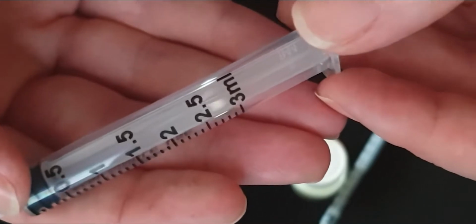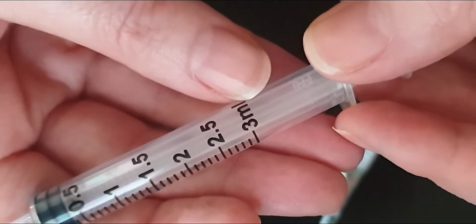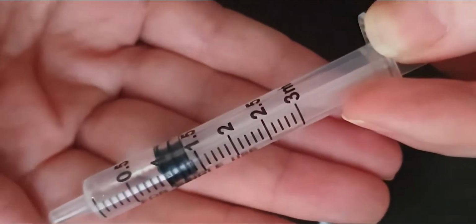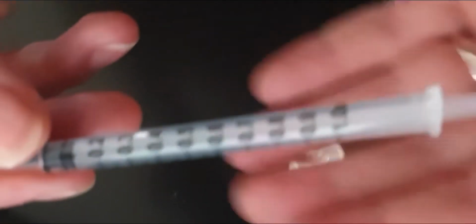Sometimes for our larger rabbits or for some medications, you'll need to give a bigger dose than 1 ml. This syringe goes up to 3 ml, as you can see here. So 1 ml on this syringe is this mark, which you can see. 1 ml in this syringe is the same as this entire syringe, so it can be easy to make a mistake there.